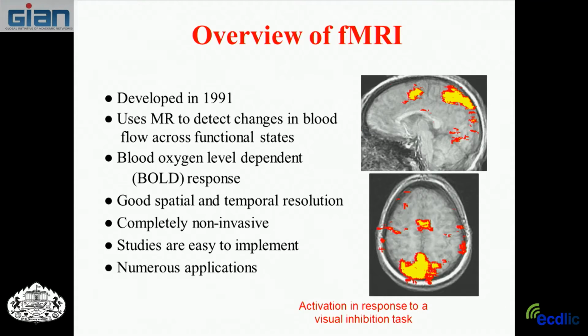Okay, then we went on to talk for a long time about functional MRI and how functional MRI uses the blood oxygen level dependent, or BOLD response, or the BOLD signal is what we call it. Functional MRI, compared to the techniques that we've used in the past, has a really good spatial resolution and a fairly good temporal resolution if we can collect our images fast enough and model this data accordingly.